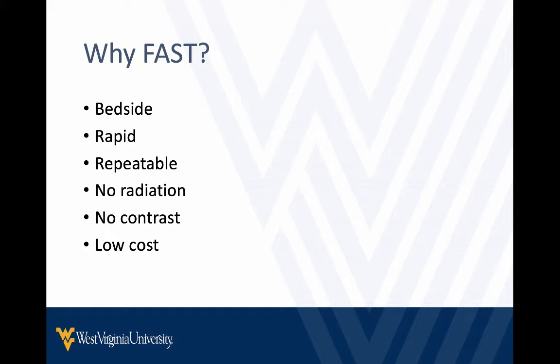I don't think it's reasonable to compare it to CT scans. CT scans are great tools and they can tell us a lot of information, but it's not a bedside tool and it can't be repeated and it has costs and downsides associated with it. I'm not saying a FAST replaces a CT scan, I'm saying FAST enhances our history and our physical exam.